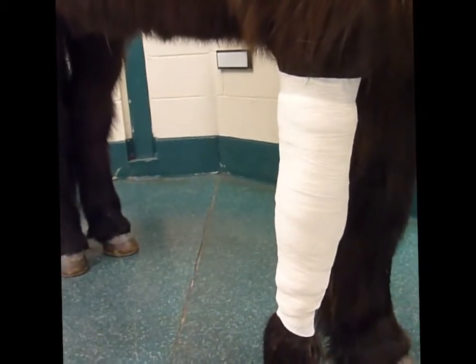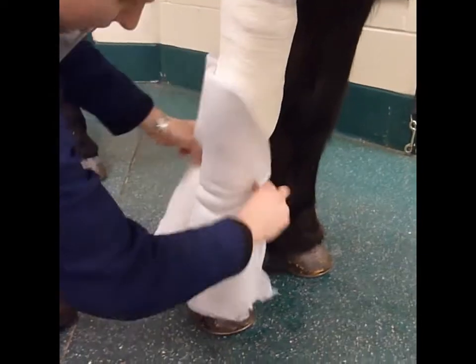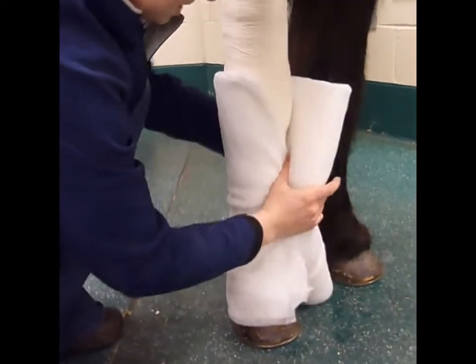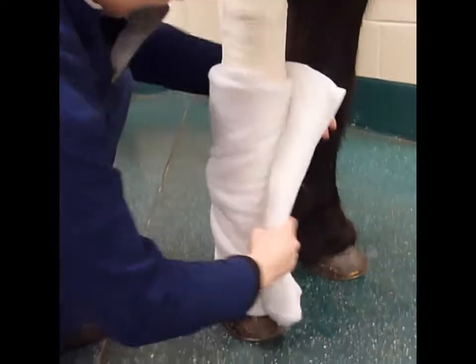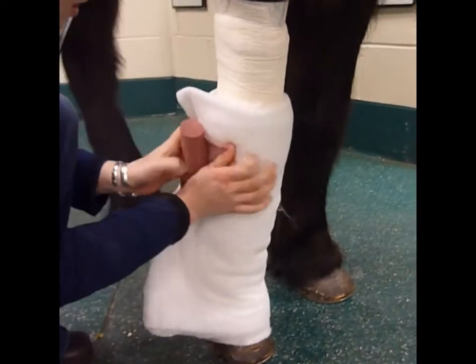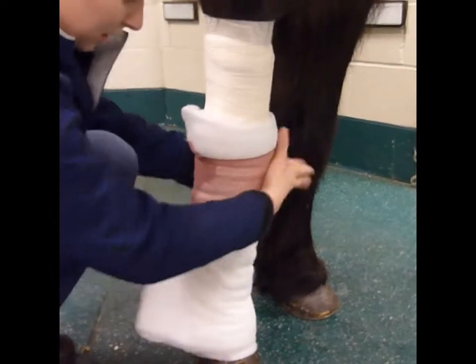There's our sterile layer here. Now that is cotton — just sheet cotton. You can go right down to his foot. He's got short little legs, so it'll come up to his knee. We'll do cotton, then brown gauze again. You can do the brown gauze pretty tight — you're not going to get it quite as tight just because it's a little thicker.